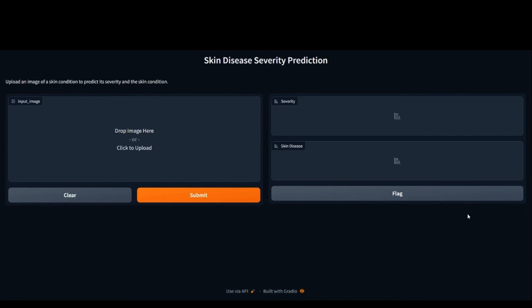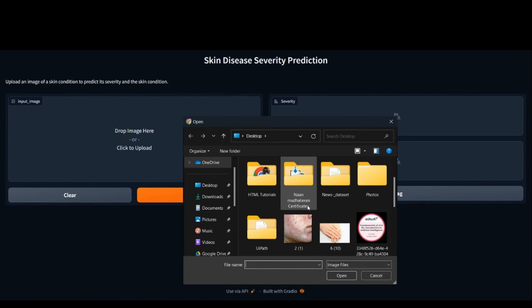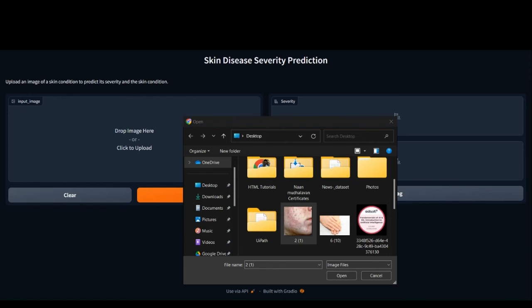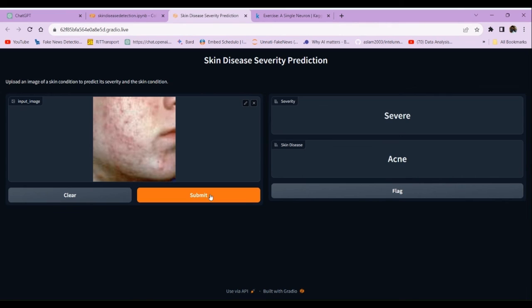In this user interface, people can share images of their skin. Based on the uploaded image, the AI model predicts the skin condition and its severity. This user interface is created with the help of Gradio. For instance, if I upload an image of a person suffering from a particular skin condition, the model predicts the severity as severe and identifies the skin condition as acne.